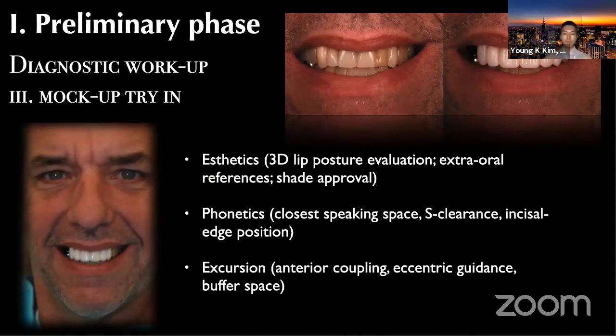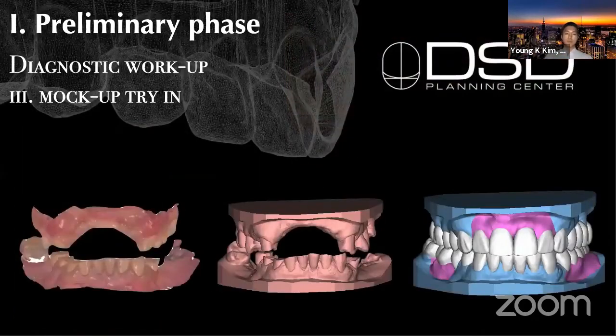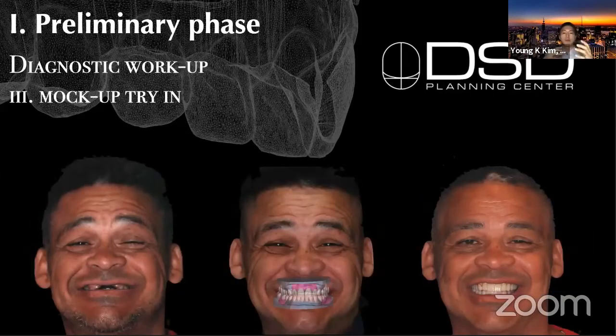We have to provide our best care, but our main focus should be the patient's interest as well. If you're doing digital smile design, which we do a lot these days, and you have a scanner in your practice, you can submit your DSD to the planning center and they do the wax-up. Of course, you take certain photographs in order to give them the proper reference points. They can merge the scans, do the wax-up, and give you a precise planning of the aesthetic analysis.